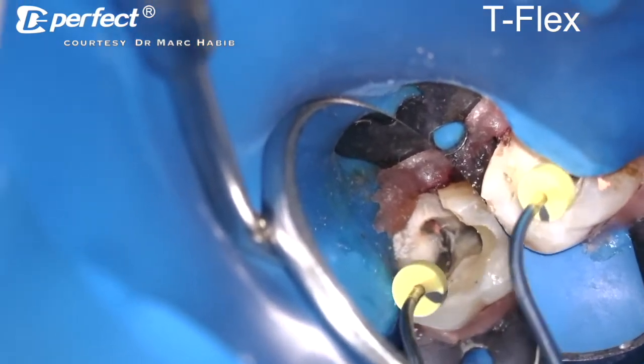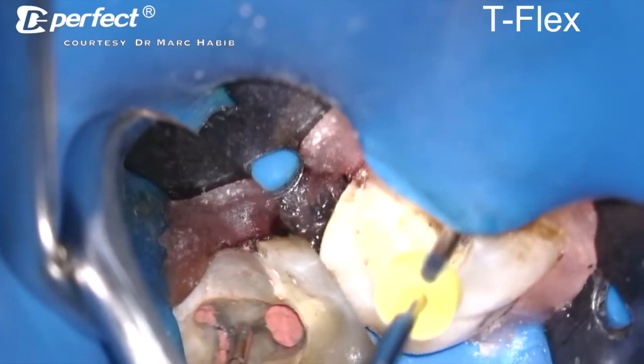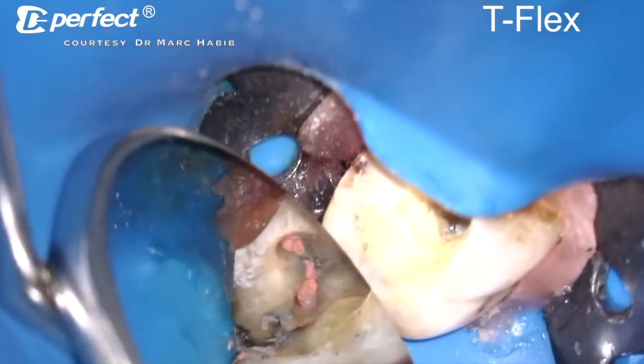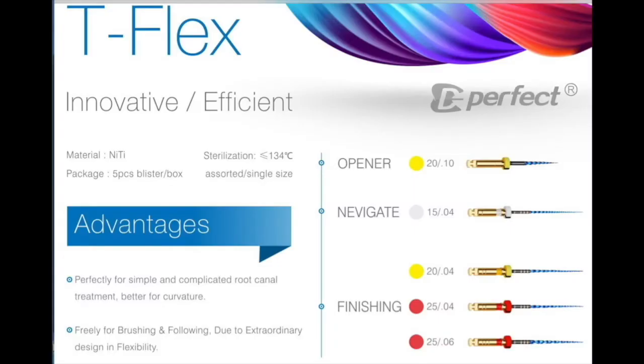After the down pack and the backfill, this is the final result of our treatment. So we have two mesial canals and one big distal canal. And this is the final X-ray. And so this is the T-Flex system with 5 files: an opener, a Navigate, and 3 Finishers.